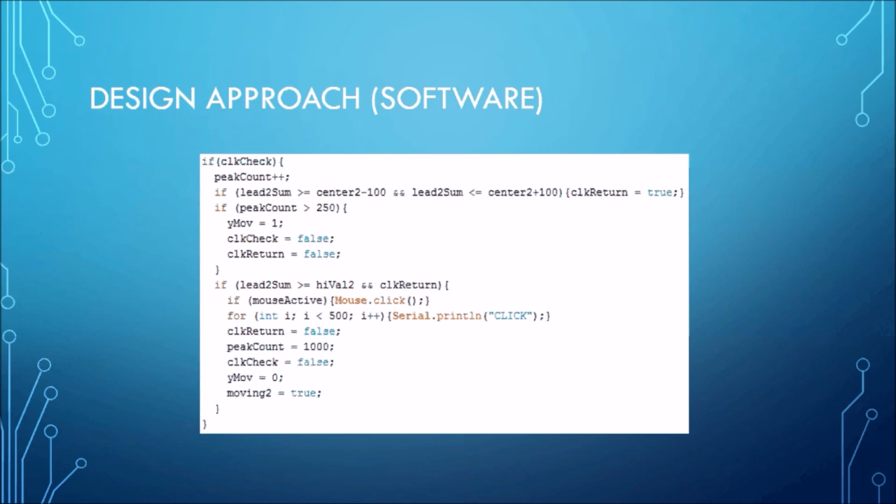Shown here is the code used to implement the mouse click function. This is activated once it detects the EOG signal has gone over a certain threshold. Essentially, a timer is activated in which the signal must return back to a normal value, and then it waits for another peak. If no peak is detected within a certain time range, then it assumes that the user wants to move the mouse up, and so the mouse will begin to move upward. Otherwise, a peak will be detected, and then the mouse will click on the screen.